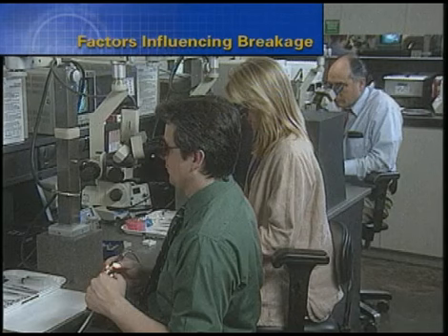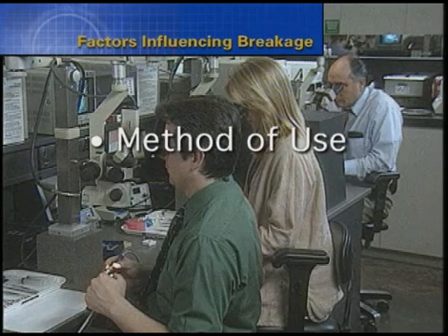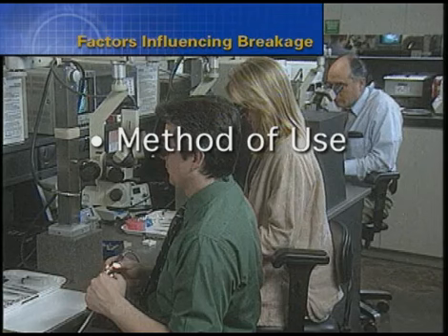At this point, let's review those factors influencing breakage. 1. Method of use. Manufacturers publish specific guidelines for instrument use. Deviations from protocol increase the potential for instrument breakage. Clinicians should never use rotary instruments in regions of the canal that haven't been first secured with small hand files.